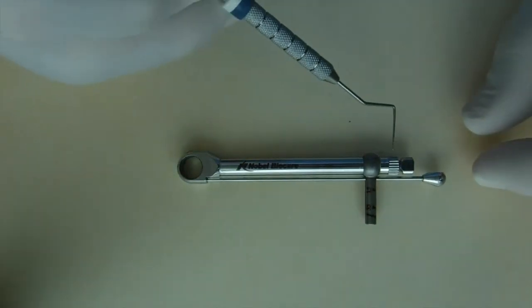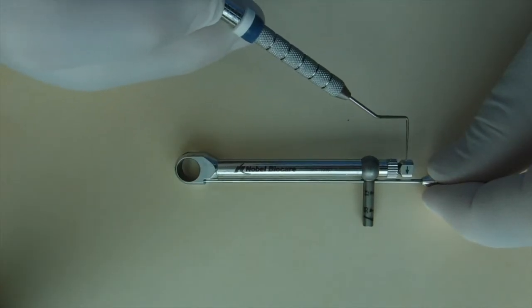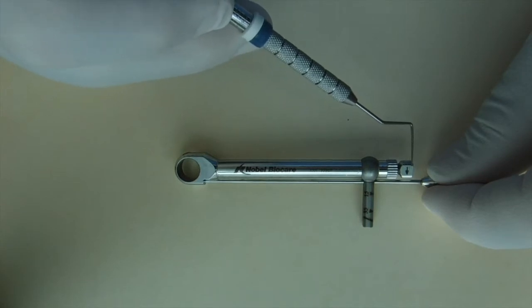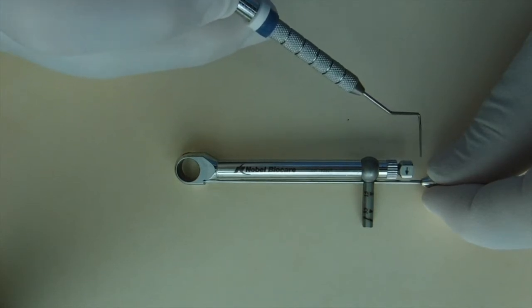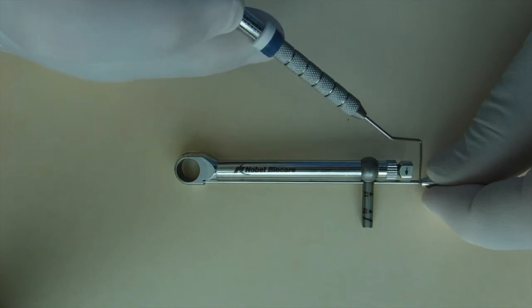You'll notice on this particular torque wrench there's a little positioning device with an arrow. This arrow should always be facing the direction in which you wish to apply the torquing force.